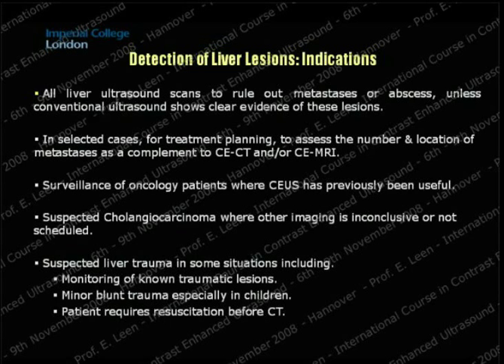Now, I guess there are several scenarios to that, because remember, if, for example, you're trying to do an RF ablation on the tumors, and these scans have been done weeks before, and you want a more updated staging of the liver, you really want to use contrast to assess the true extent of the disease in the liver parenchyma.